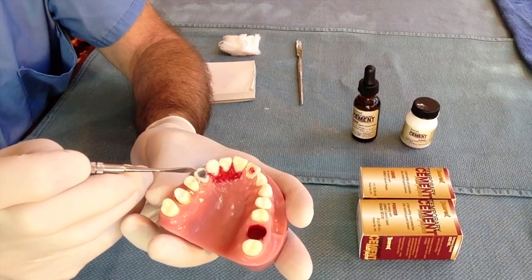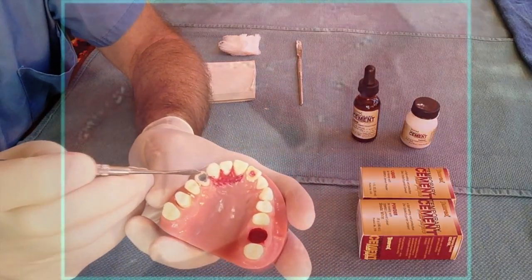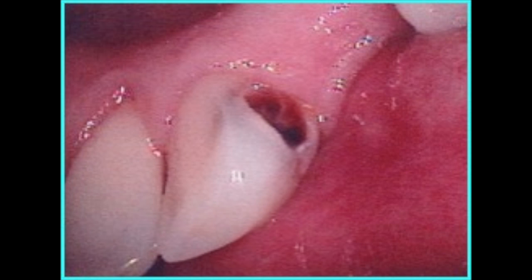Painful caries are usually deep, discolored, and are often tender to percussion. A superperiosteal injection prior to applying the cement will make the patient more comfortable during the procedure.